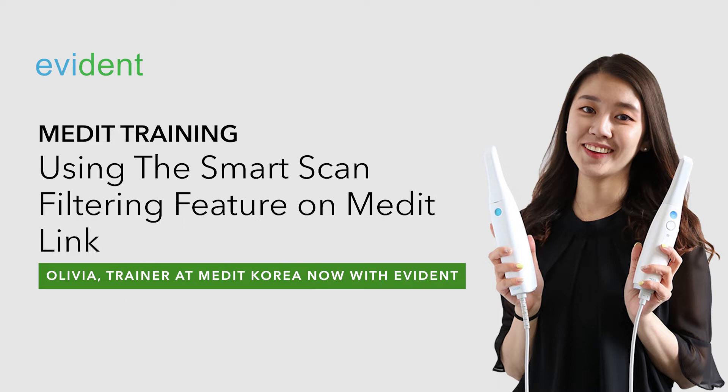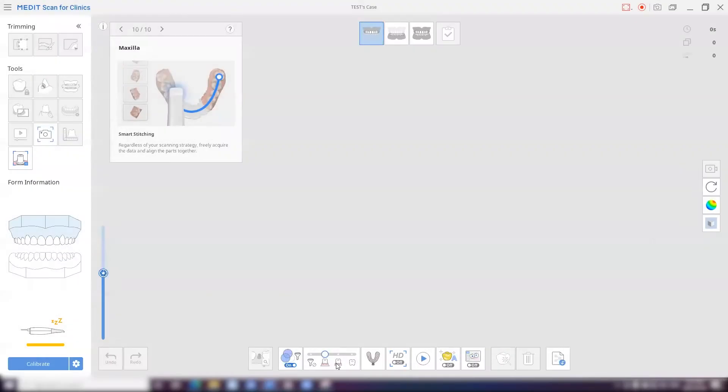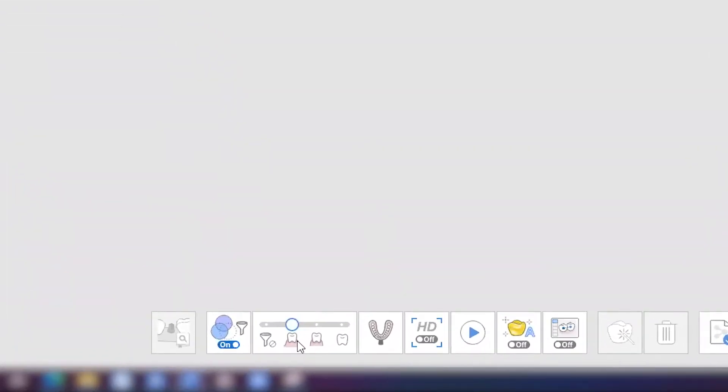Hi, this is Olivia. I have a scanner training program here at Avedent. Next, this is a smart scan filtering option. It helps filter unnecessary soft tissues. You can set up the smart scan filtering level according to the case.